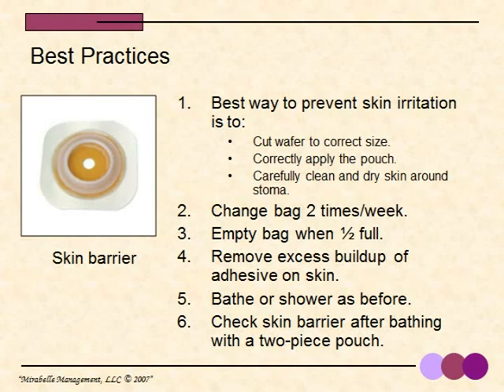Change the bag 2 times a week. Empty the bag when it's half full. Too much weight will cause it to start to pull away from the skin. Remove excess buildup of adhesive on the skin. And remind the person that they can bathe or shower as before. It's their choice. Water and soap will not flow into the stoma. And check the skin barrier after bathing with a 2-piece pouch to make sure that it's still attached properly to the skin.